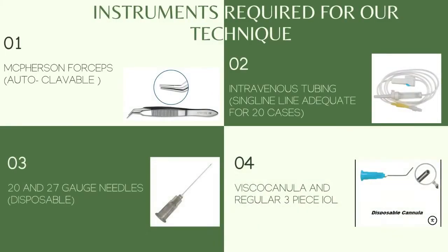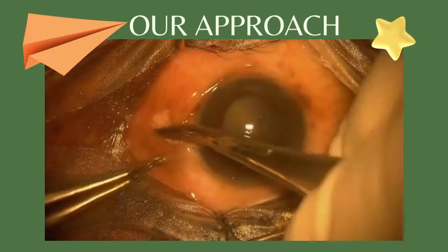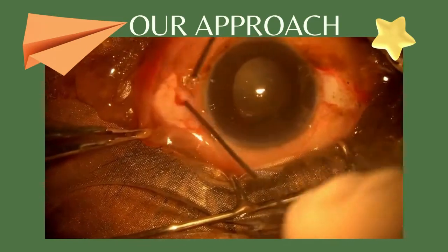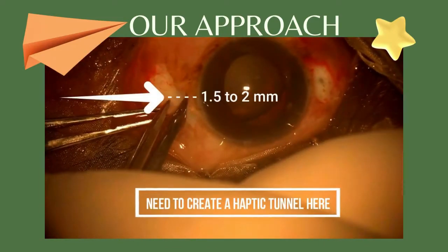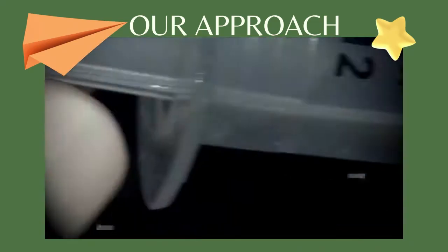Our technique requires only the very basic items, and in the following video we're going to demonstrate how to perform an SFIOL using them. After the regularly formed 2x2mm peritomy at the 3 and 9 o'clock, the scleral surface is lightly cauterized and labeled. This is when our first custom instrument comes into play.